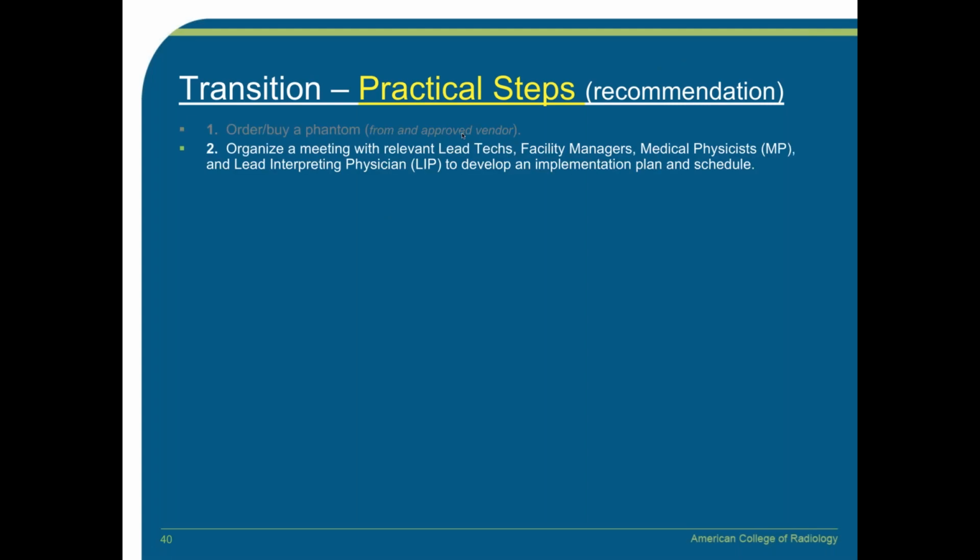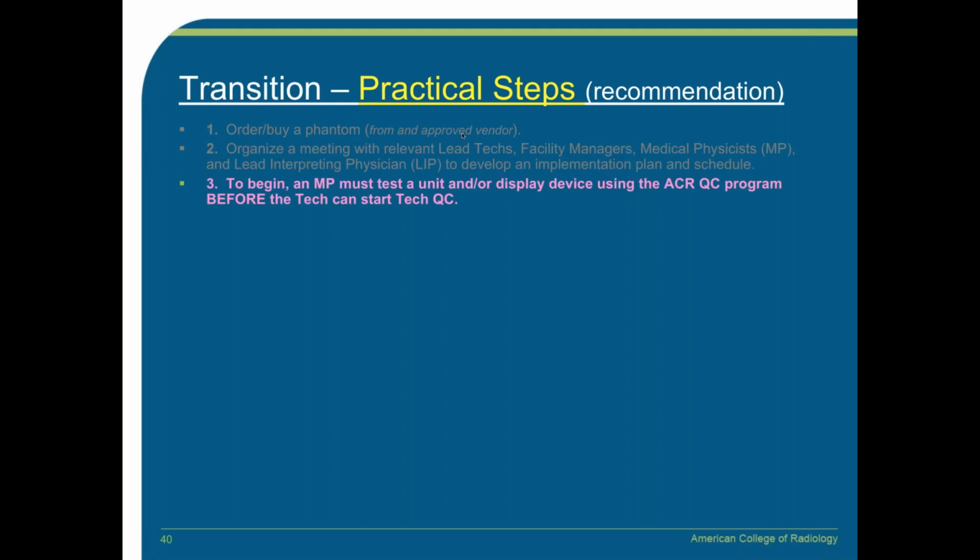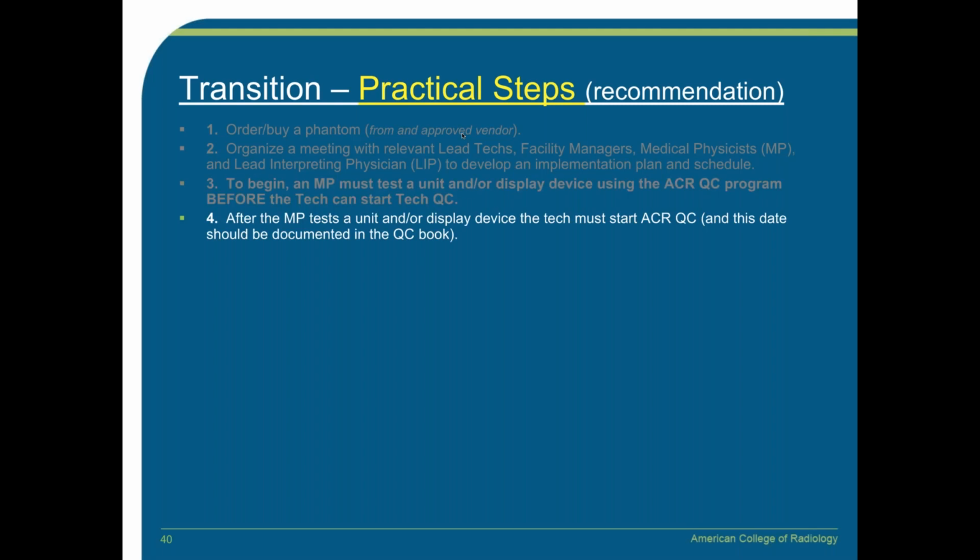Then we recommend that you have a meeting with your lead tech, your facility manager, your medical physicist, and radiologist to talk through the implementation plan and schedule it, because we all know that all the units and workstations are on different testing schedules, and you have to figure out what order and how to optimize that. And again, to begin, the physicist must test the unit before the tech can start tech QC. So this is one of the big take-home messages: before a unit or workstation can go into the transition to the tech QC, the physicist has to test the unit.